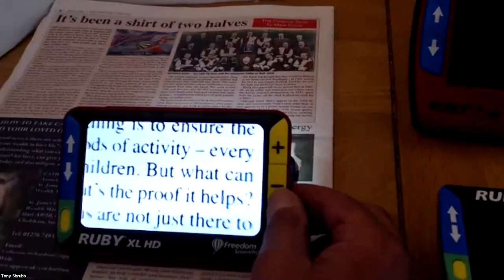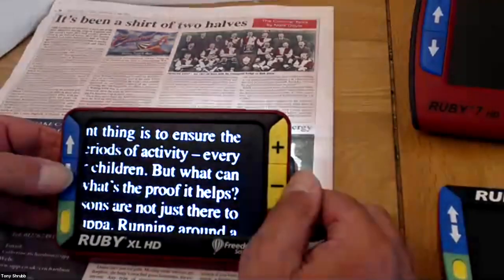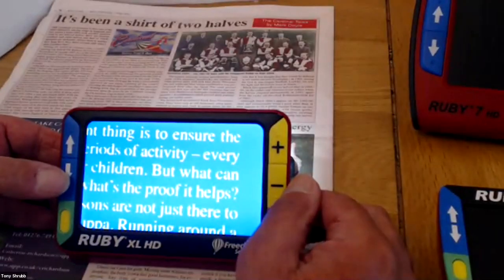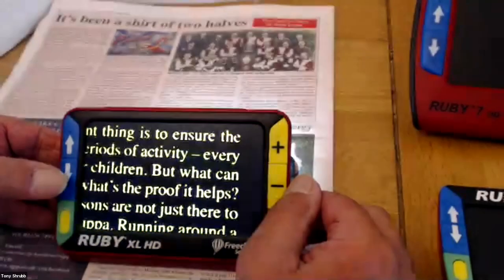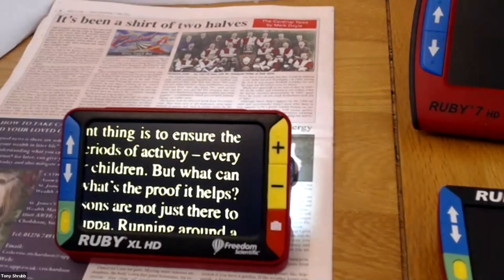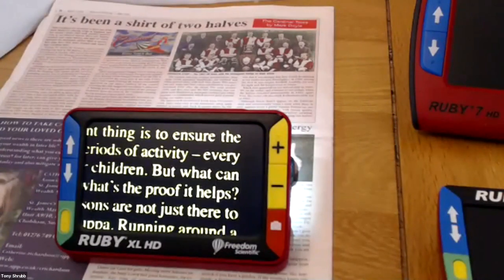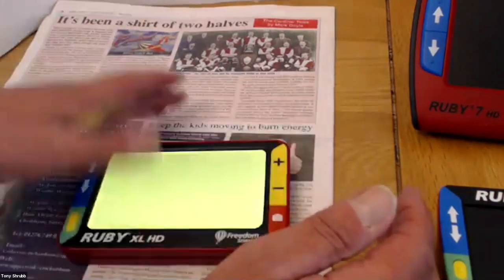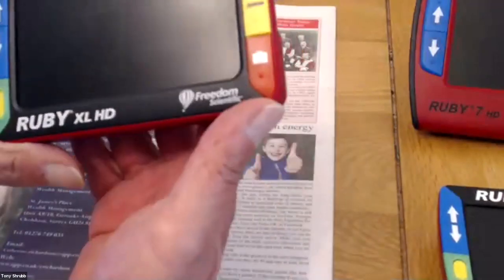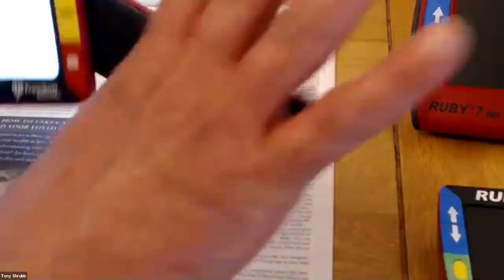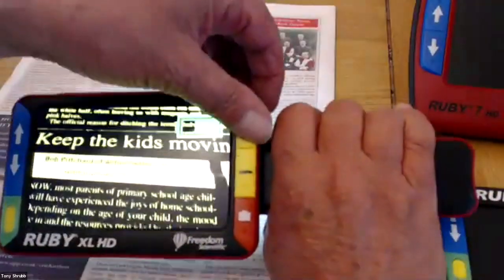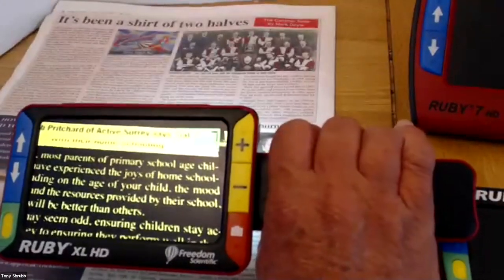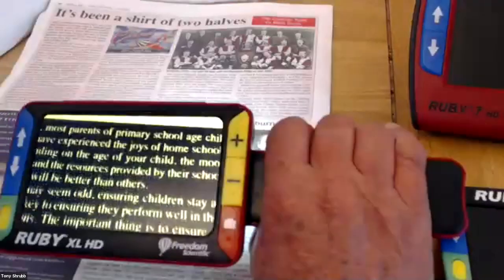This is a newspaper, so the quality of the print isn't very good. That's full colour, but if I change it to high-contrast black and white it's a lot sharper and clearer. We can go through various other colour combinations — negative, blue and yellow, and yellow on a black background. I'm told that yellow on black suits a lot of people with macular disease — hence the Macular Society using those as their house colours. If I fold it flat it switches off, but there's a handle for handheld use.